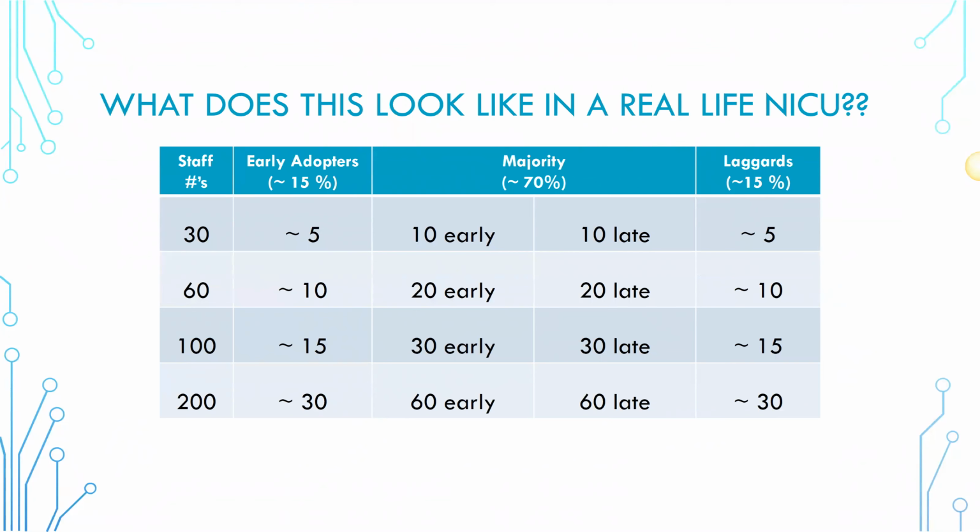It's important to know that each device does have a way to event mark. You can either create a list of high priority events, or you can create a custom pick list. I think that makes it the easiest for bedside providers. And especially if you ask the nursing staff to event mark, then if you are reviewing the tracing, you need to utilize those event markings. They provide an enormous amount of value, but only if we look at them. So we definitely want to look at those event lists and use them in our interpretation.